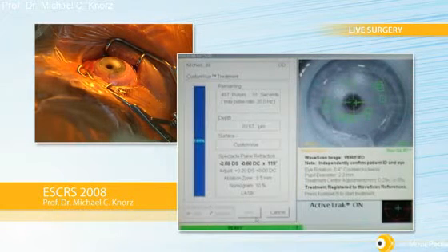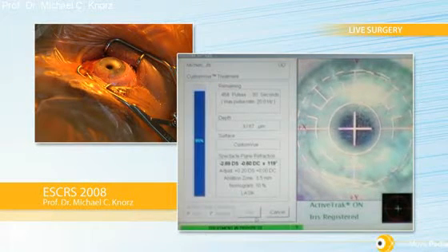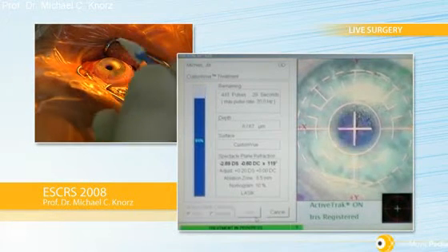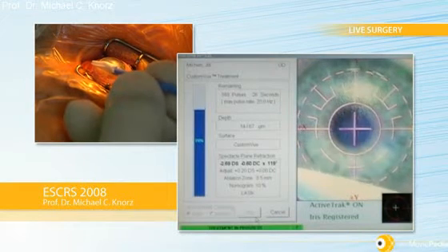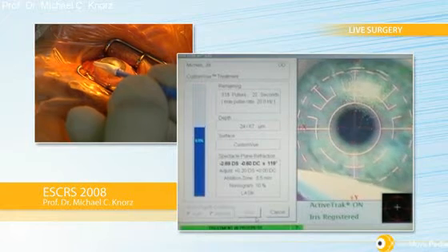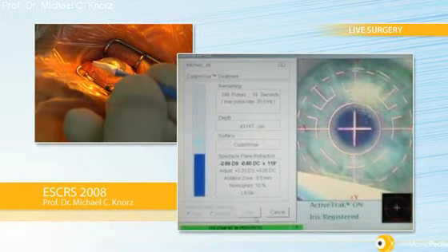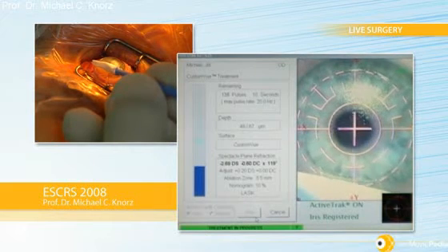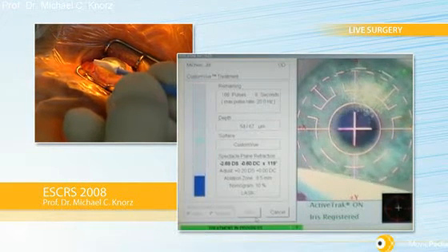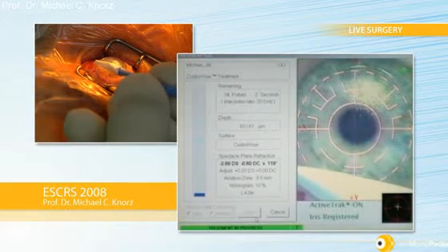Now the treatment starts. The patient keeps looking at the blinking light. I will use a Merocel sponge just to cover the hinge to protect it from the ablation. We have an excellent treatment here — the patient is very cooperative. As I said, it's a 7mm optical zone. This is a variable spot laser, with spot size varying between 0.5 and 6.5 mm, which speeds up the ablation time considerably.